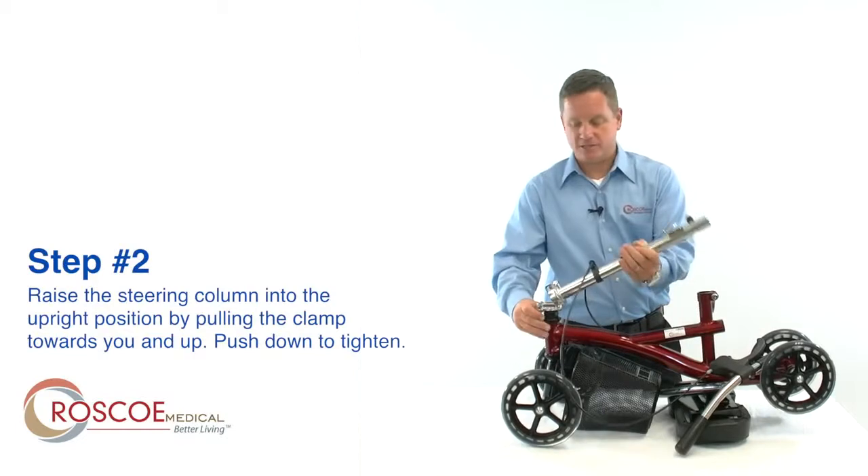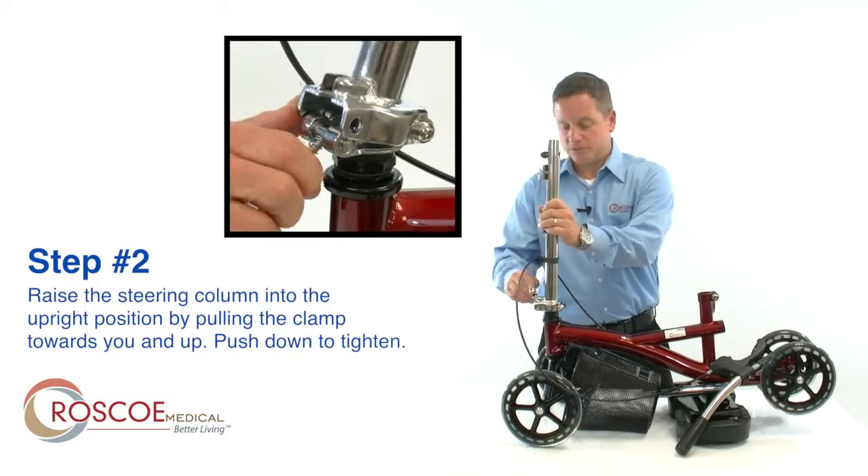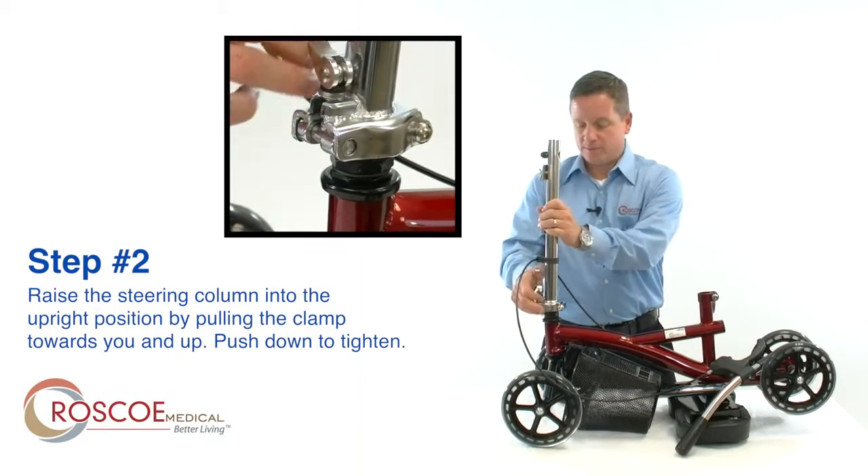Step 2: raise the steering column into the upright position. Pull the clamp towards you and up, and then push down to tighten.